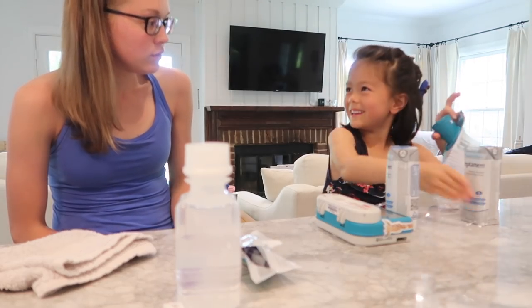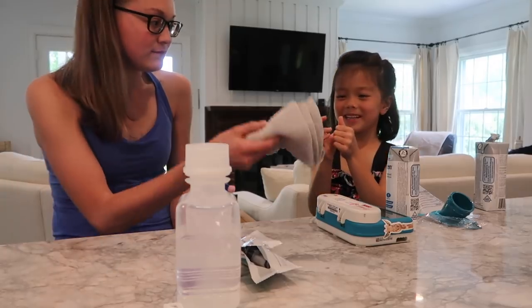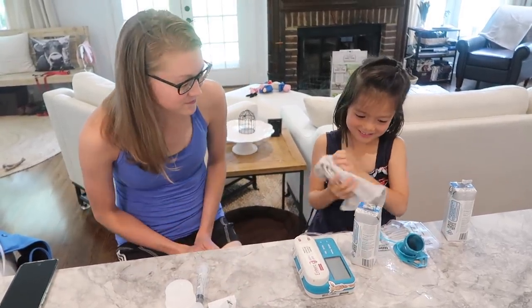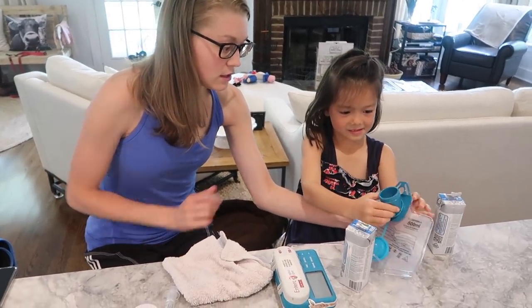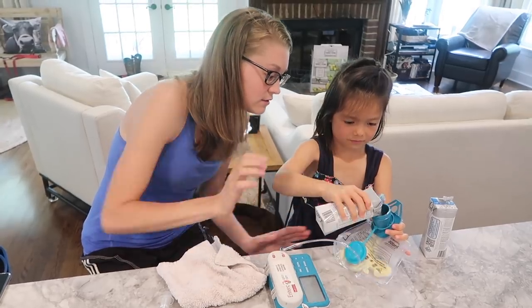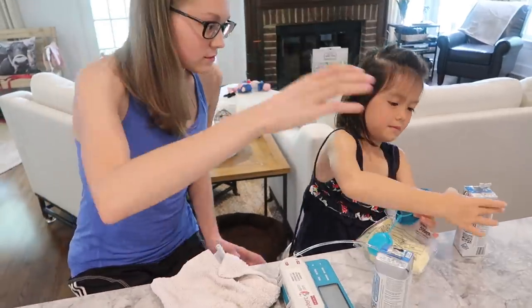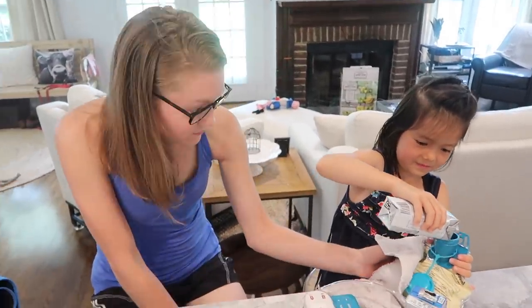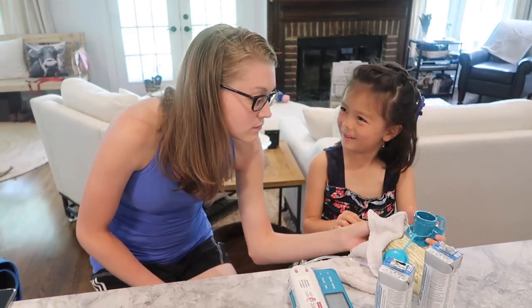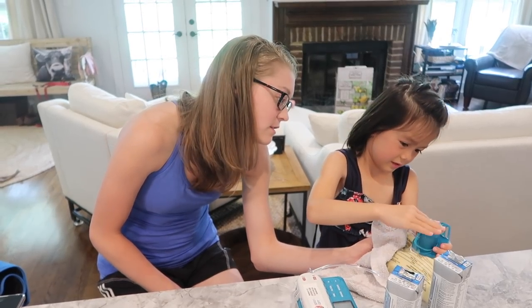I don't know how to hold all this. I know, it's tricky. You got it — it's on me. You're good. Oops — happens all the time. You just kind of hold it with your left hand. Yep, and then take this and go right over it. Wipe it up — first let's close it, because I found that I spill it if I don't close it right away.